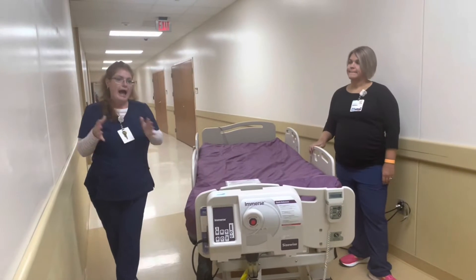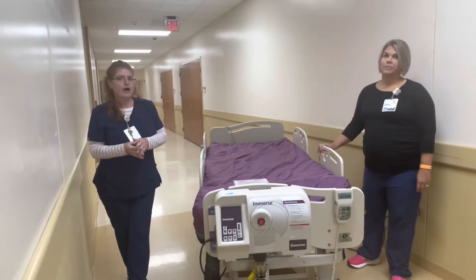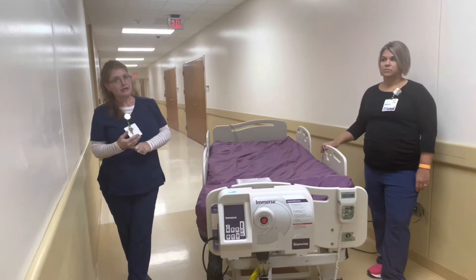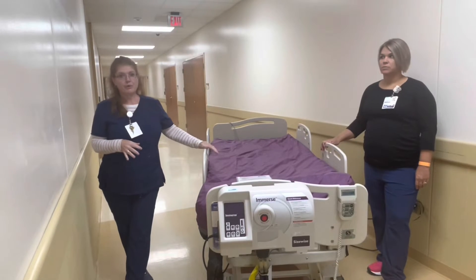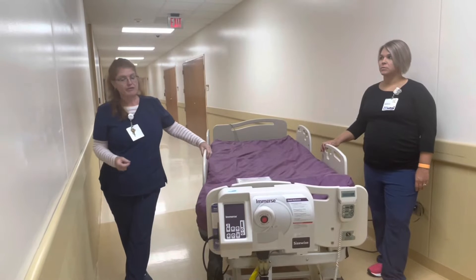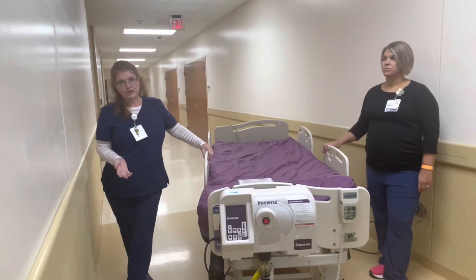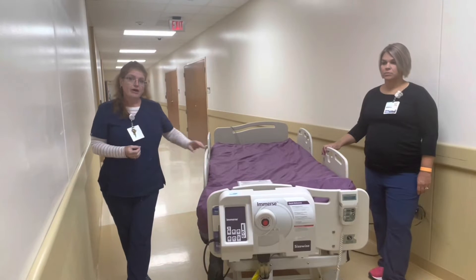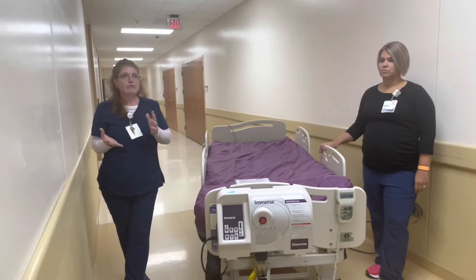Our beds that we have in-house are therapeutic and prophylactic for stage 1 to stage 4 pressure injuries. So we do not need to bump up to this bed instantly if a patient comes in with a pressure injury. Some of our indications are if they come in and they have pressure injuries or wounds on multiple planes.